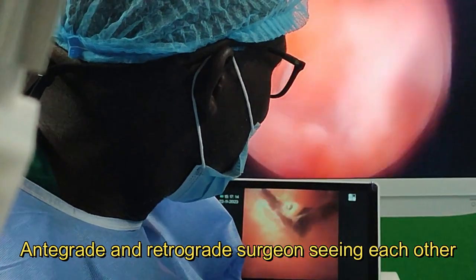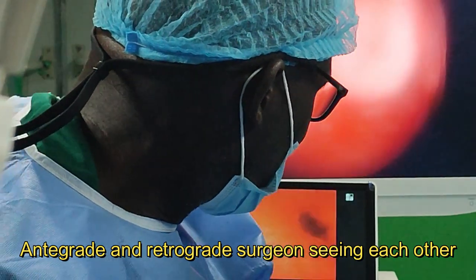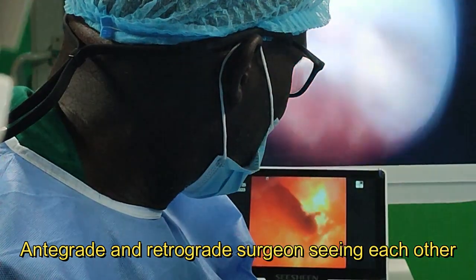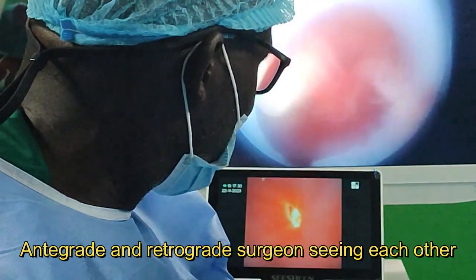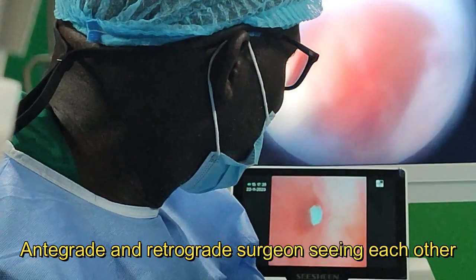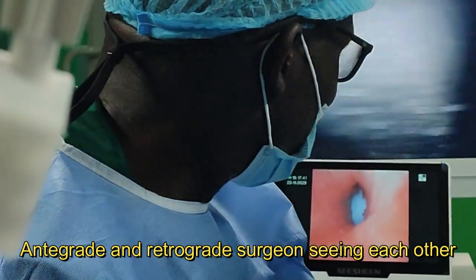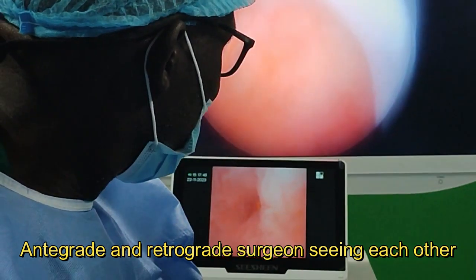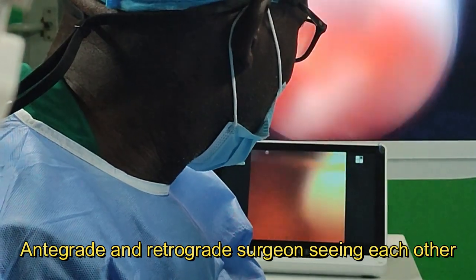So, just go in, then the calyx there. Just go in. This is the place I was struggling to enter. Okay, hold on. That's the thing there. Move your scope back. Move it back, so that I don't need to. Yes, so that's how I come in now. So I've been drawn for you.